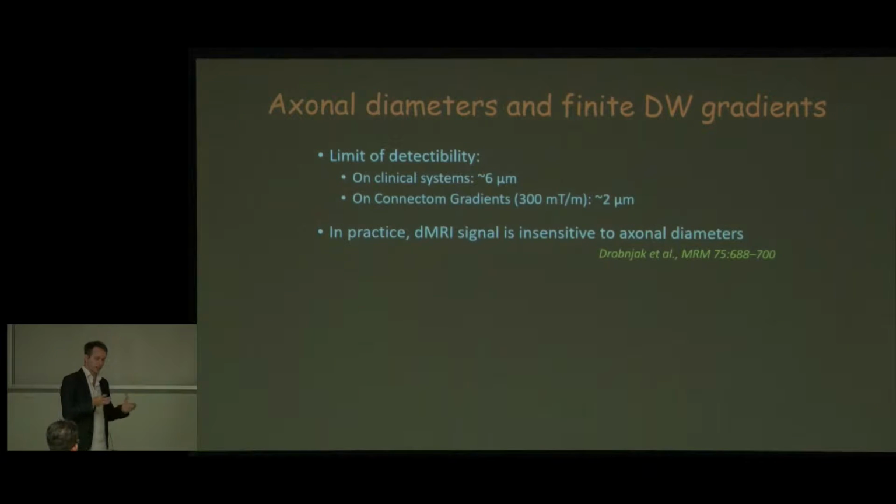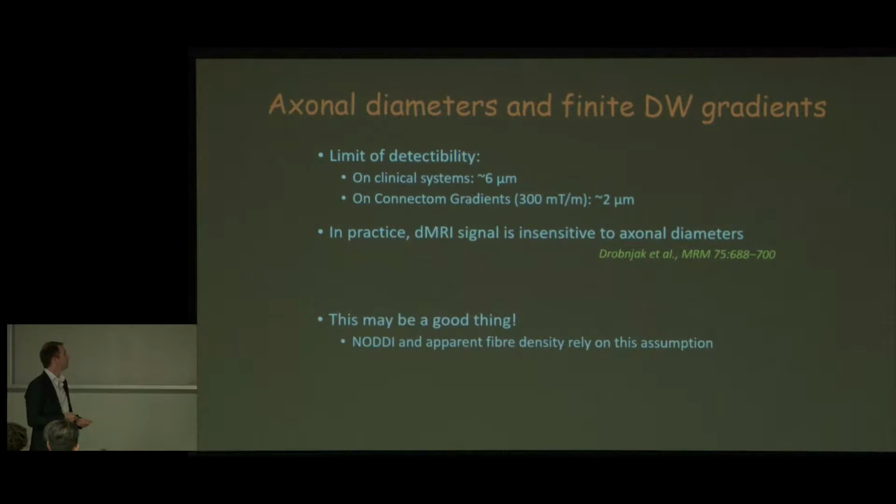And that's a theme that I find comes up quite a lot. The models that we have are quite simple, and there's a lot of ways to affect the signal that aren't included in the model. So when you see a difference and you interpret it as one thing, there's a very good chance that it's actually something else. We just don't know.